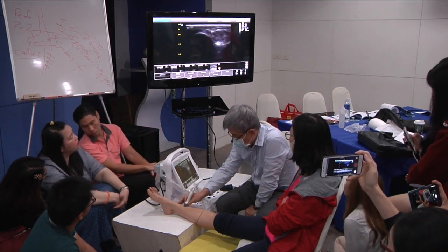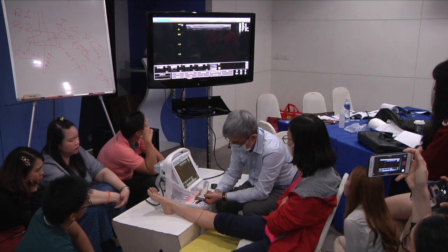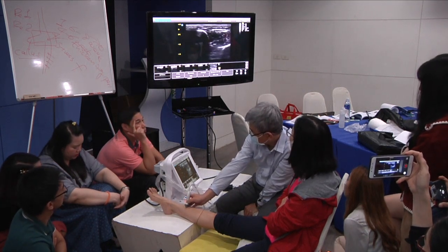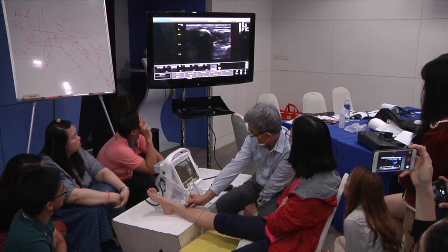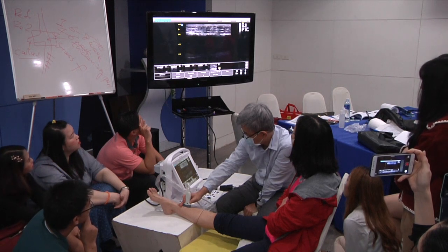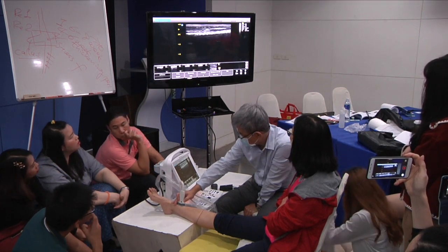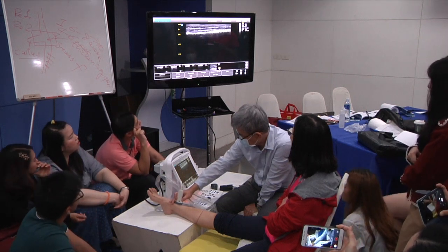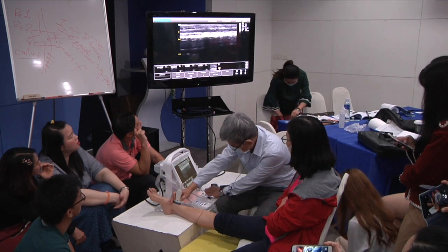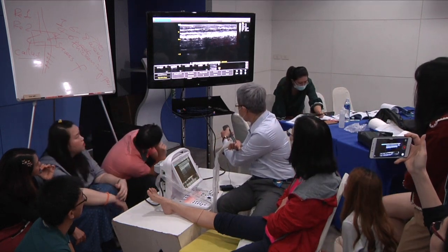So, when we look at the tibialis anterior tendon, we found the tendon of the tibialis anterior. Put it in the middle of the window, 90 degrees. This is the tendon, very close to the cortex bone of the tibia. Very close. Then you follow it all the way to the insertion. All the way to the insertion. This is the tendon, right? There are tendon fibers inside.